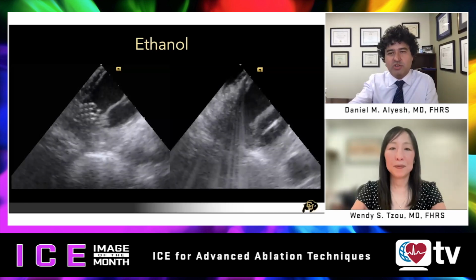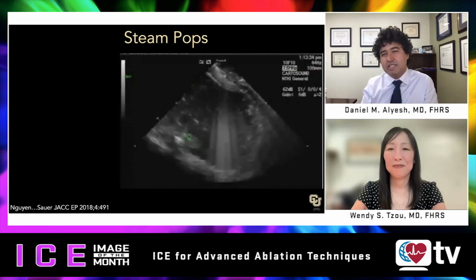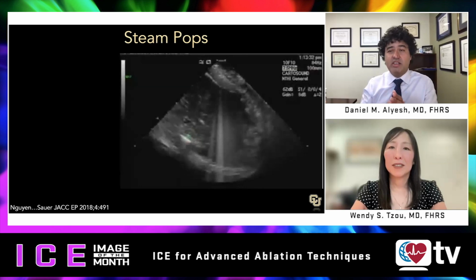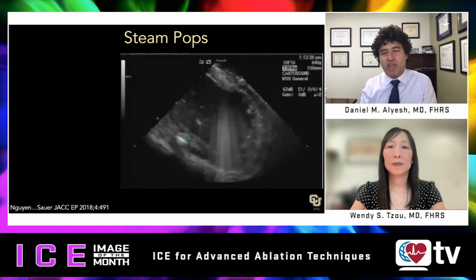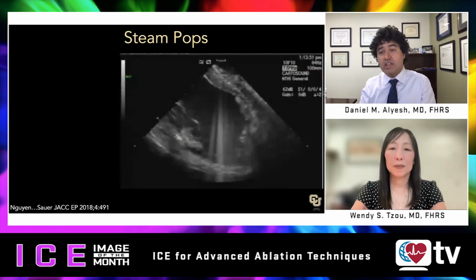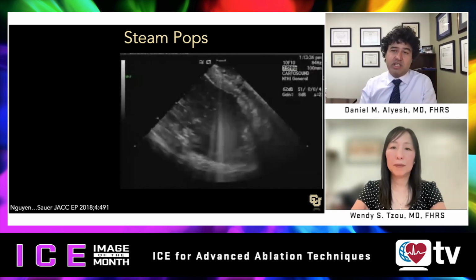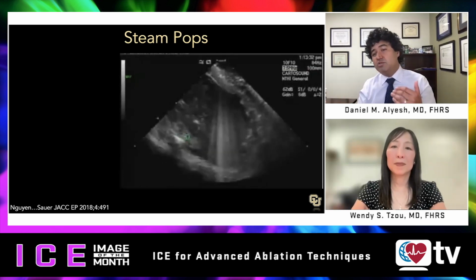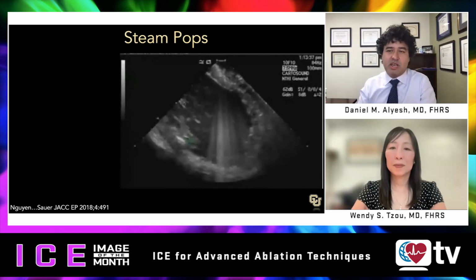Okay, so jumping to the heart of the matter, monitoring for steam pops. I'll say another caveat is that applying ice to all these different ablation technologies clearly has been valuable. And the future, by and large, one day will be a PFA-based ablation energy source, I believe. And the jury is out to see how we'll apply ice in that circumstance. I've played around with it a little bit myself, but I'll take us back to monitoring for steam pops, monitoring for safety. You did some great work on this. Why don't you tell us a little bit about it?